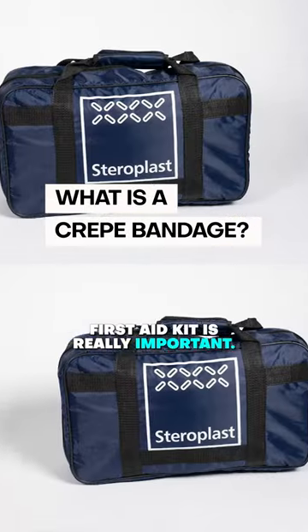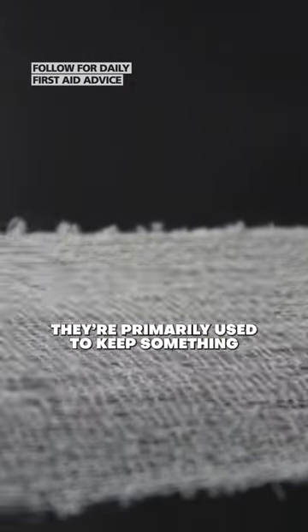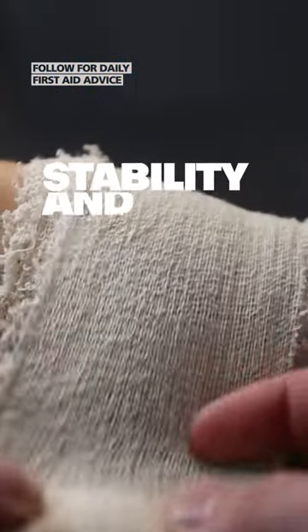Having a crepe bandage in a first aid kit is really important. Crepe bandage is a lot more rough and a little bit stretchier than a normal bandage. They're primarily used to keep something in place that's already doing another job, provide some stability and pressure on that area.